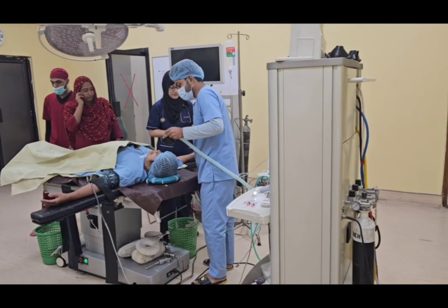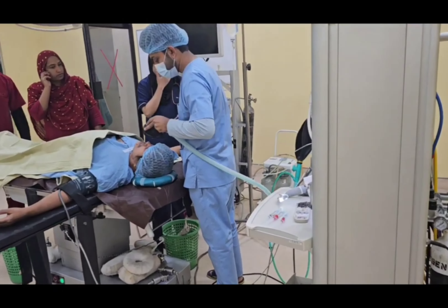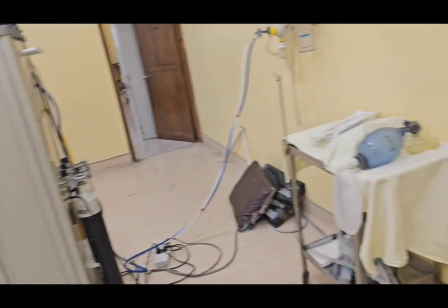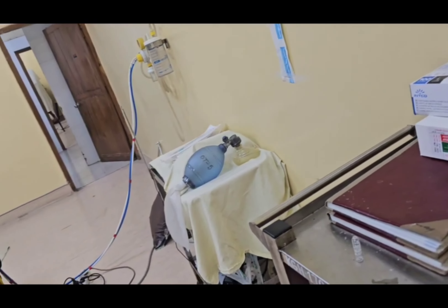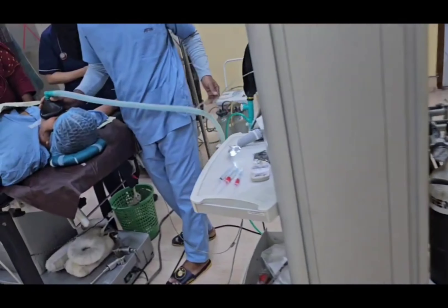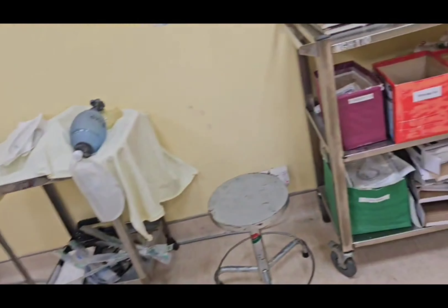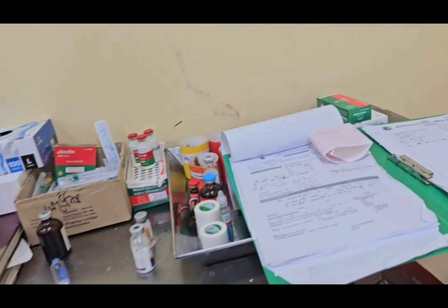Welcome to Oganbabu. Today we are present with a patient with cholelithiasis along with hypertension. Our plan is to do laparoscopic cholecystectomy. Now we are preparing for the general anesthesia.